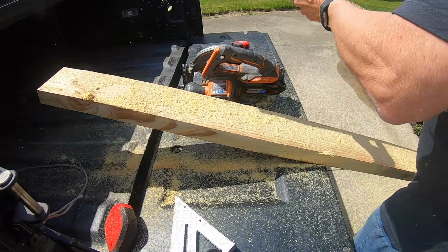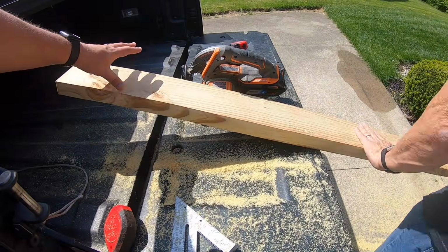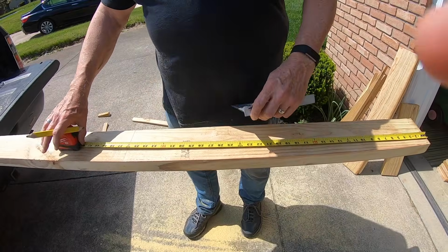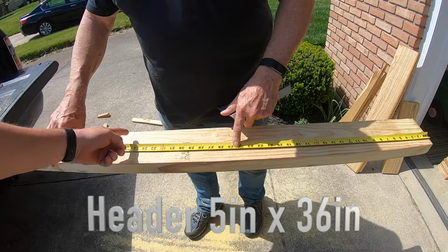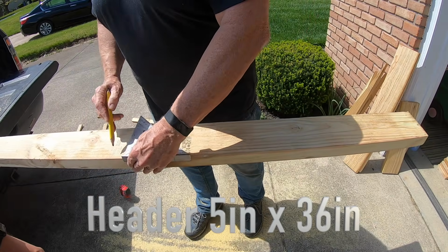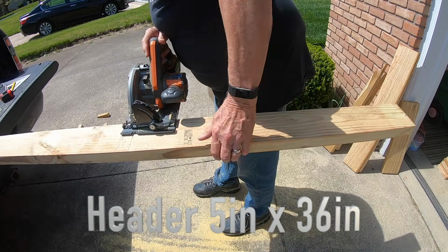And that is it right there. You just go ahead and pull that off, and the whole rest of it is cut right down to size exactly how we want it, all the way down. So go ahead and measure your header out. Remember, this is that 5 inch by 3 feet. So we're going to go ahead and mark it there. Then what you're gonna do is go ahead and cut. So you're gonna take your circular saw again.